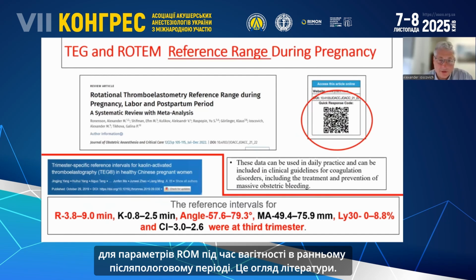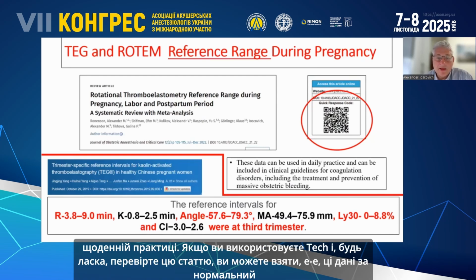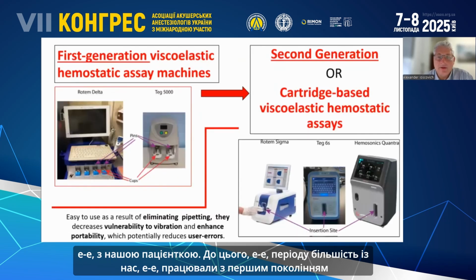We don't use ROTEM, but we performed this review for our colleagues that use ROTEM in daily practice. If you use TEG, please check this paper, you can take this data as a normal range for the end of pregnancy, and we use these numbers for our understanding of what happened with our patient.